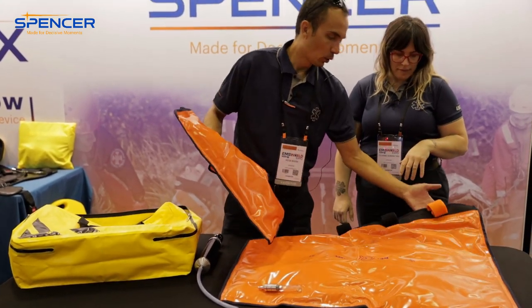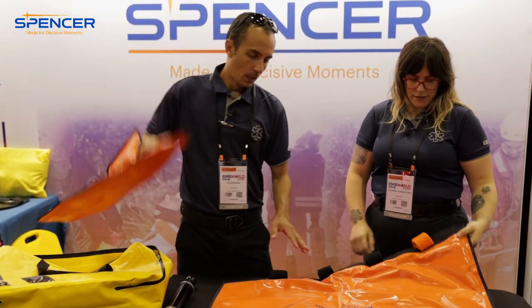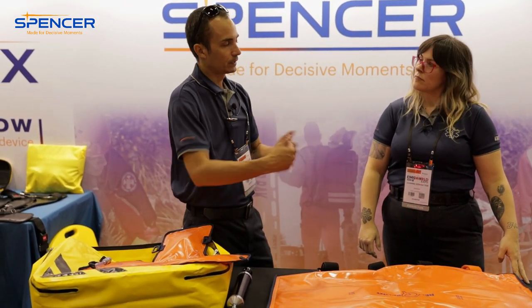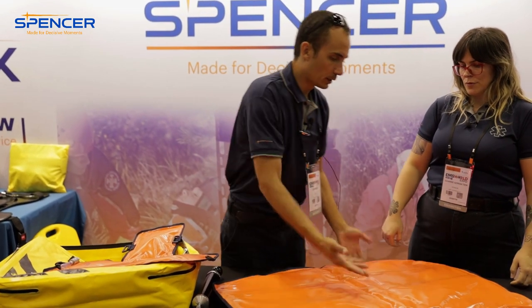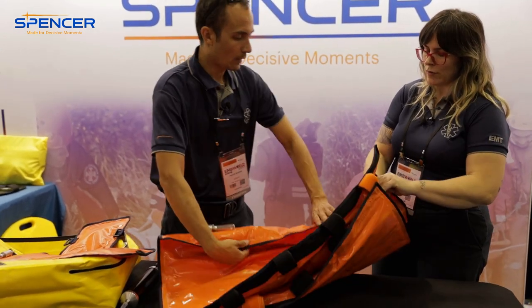One thing to know is that the orange on all Spencer products is always on the top. Another interesting thing is that you don't need to use this straight — so if somebody has an angulated fracture, you can angle it to mold around where they are. It can go around.